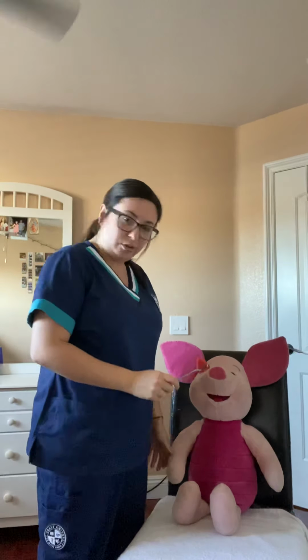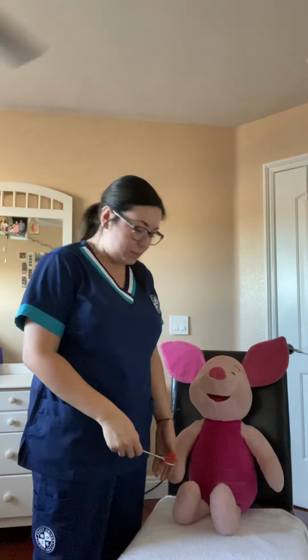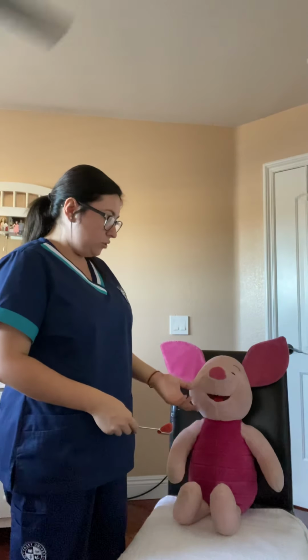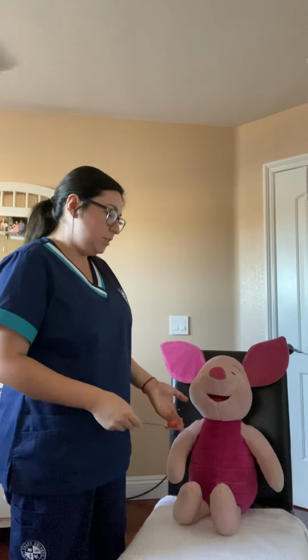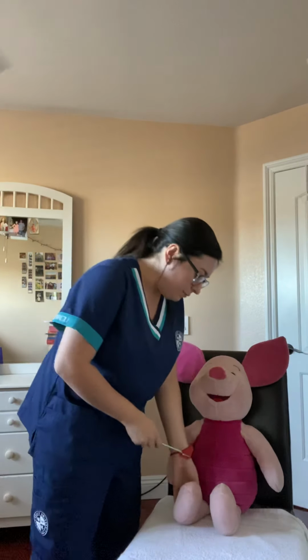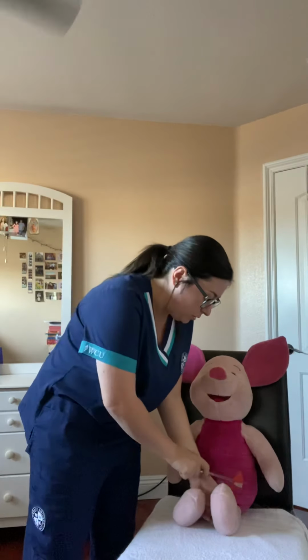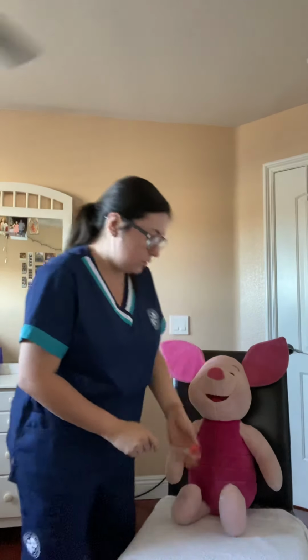And now I'm going to go down to the reflexes of the legs. I'm first going to ask the patient if she's had any knee surgeries or knee injuries, and she states no. So I'm going to be hitting the knee, and I'm going to be seeing extension of the lower extremity. Okay, extension. All right.